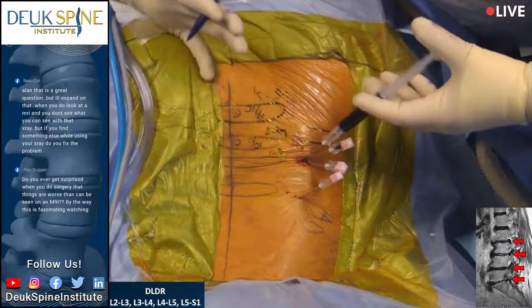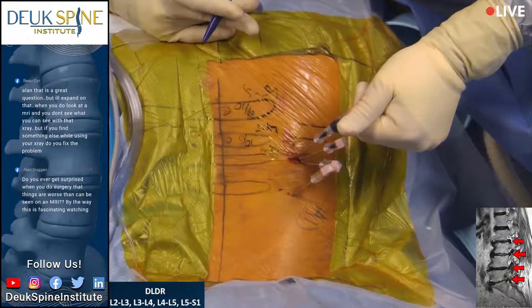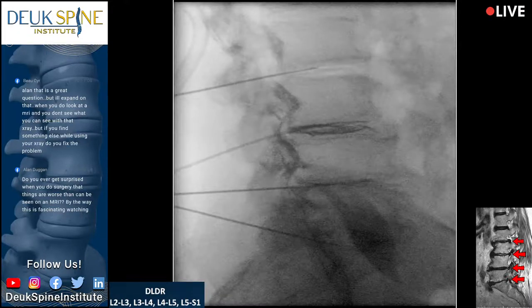All right, stay still. How bad is that? What number was that right now? We just tested you. 0 to 10. 10. All right. And is that where you get your pain?